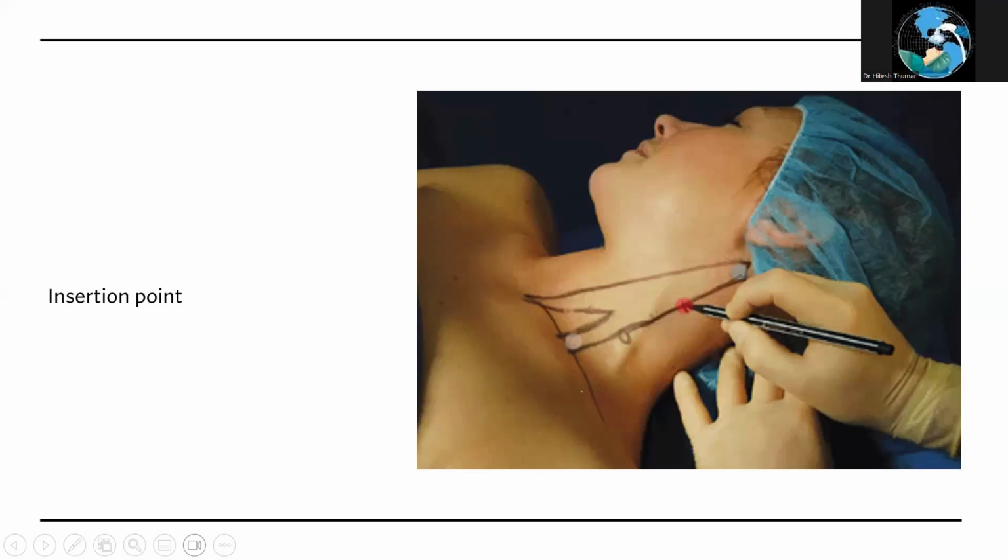Take a long insulated needle, more than 10 centimeters, and insert just 5 centimeters, not more than 5 centimeters. So up to 5 centimeters, you will be able to hit the mandibular nerve, right? In the video I saw the entire length of the needle inside, so I thought whether it is 5 centimeter or 10 centimeter. Small needle, but we'll go for a 10 centimeter needle.